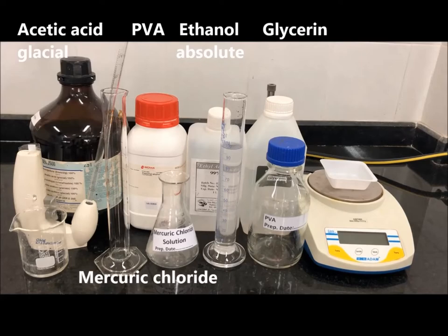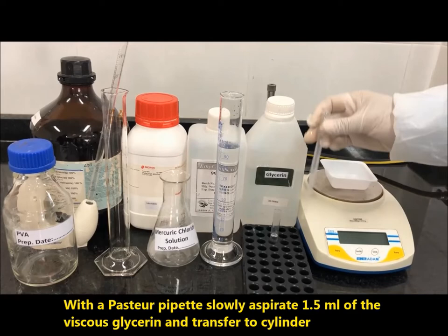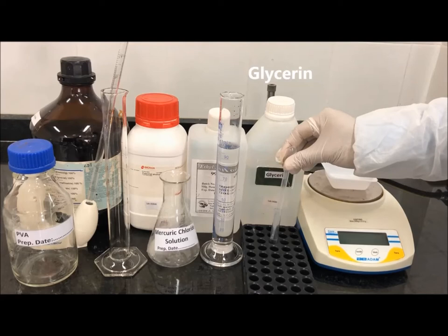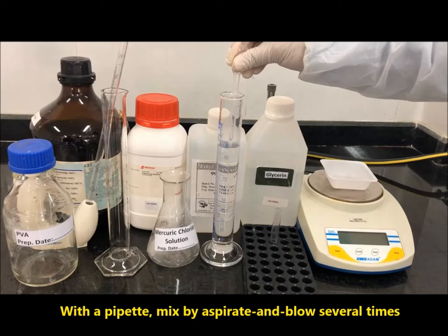With a Pasteur pipette, slowly aspirate 1.5 ml of the viscous glycerine and transfer to the cylinder. With a Pasteur pipette, mix by aspirating and blowing several times.